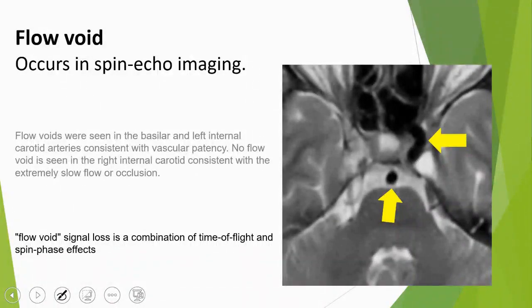This technique can be relied upon in the process of MRI angiography because you can image the arteries in this way, or the plaque. After that, you can perform something called the subtraction technique, which subtracts the existing tissue from the blood vessel and provides you with images. But in reality, they rely more on the time of flight. What is this time of flight? We have a problem with that.